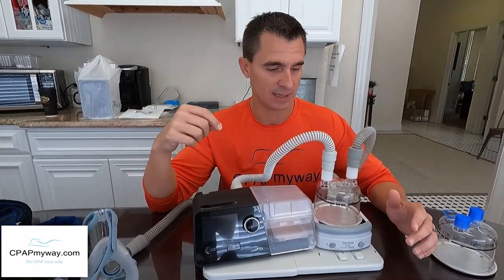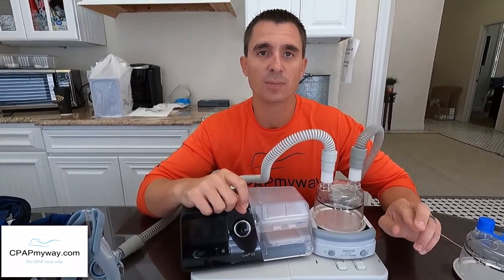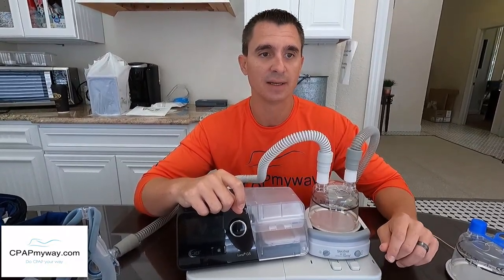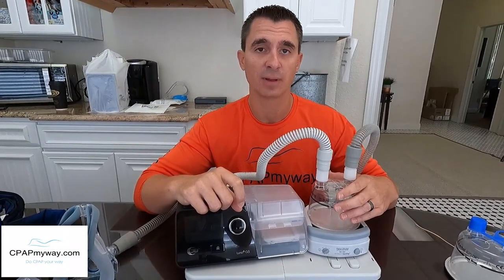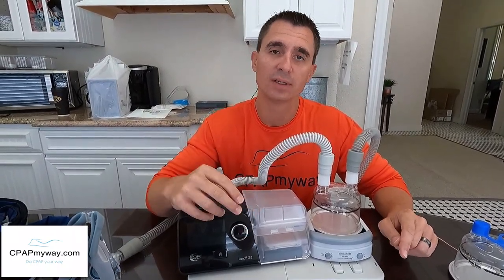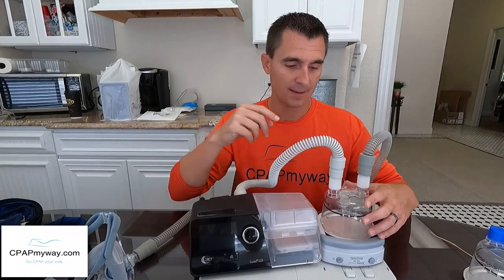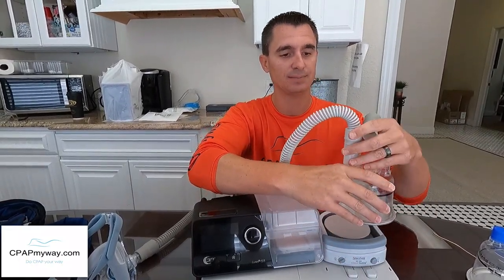Finally, let's talk maintenance. This is a heated humidifier just like the one on your CPAP. Fisher & Paykel recommends daily maintenance: rinse the humidifier chamber daily and air dry it daily. Weekly, wash it with a one-part vinegar, two-parts water solution — swirl it around well, dump it out, rinse thoroughly, and let it air dry.